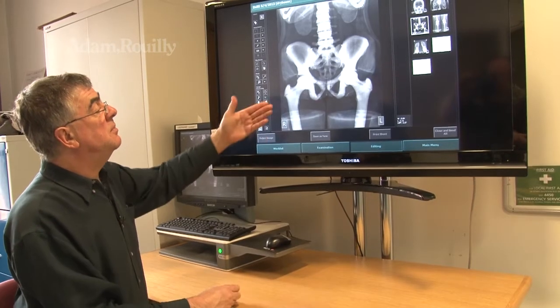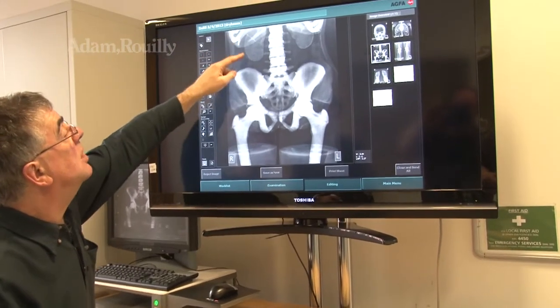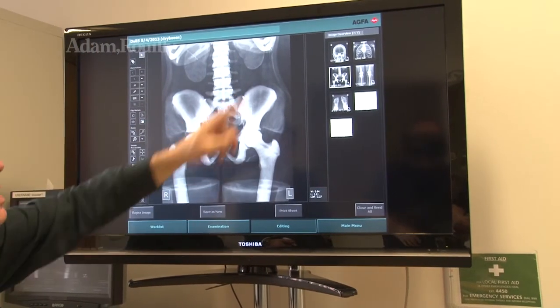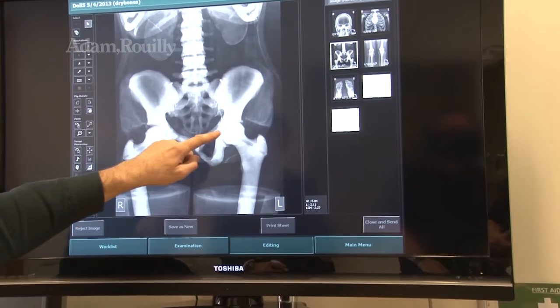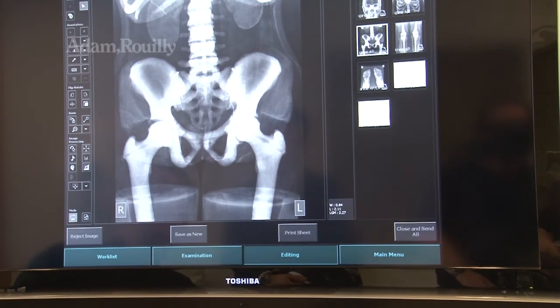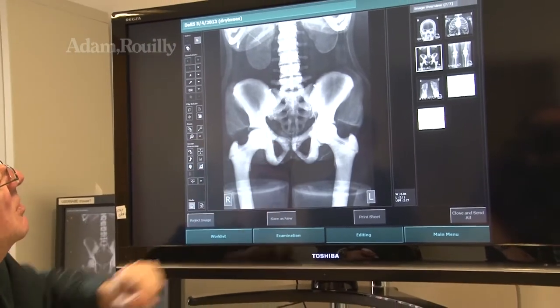For completeness, the abdomen that we've taken here with the pelvis. Again, on the doll, you can actually see kidneys that have been manufactured to fit in there. We have the outside skin of the doll again. And again, here, you can see how it's been manufactured to their standards with the fixations to hold the hip joints in place. Nice straight spine, as you'd expect, and a nice symmetrical appearance.